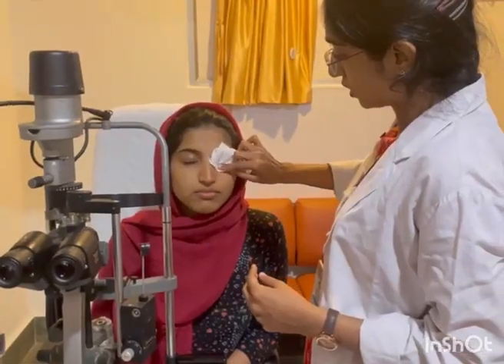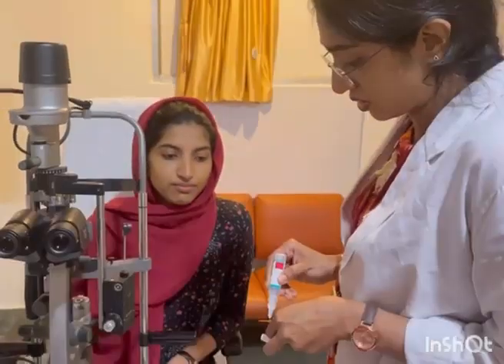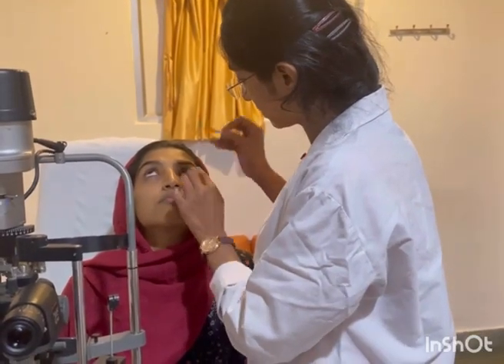First, we have to anesthetize the eye and wipe off the excess. Then we have to stain the eyes with a fluorescent dye and wipe off the excess from the eyes.